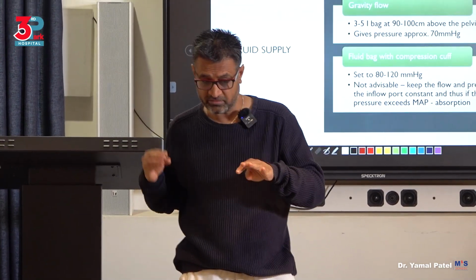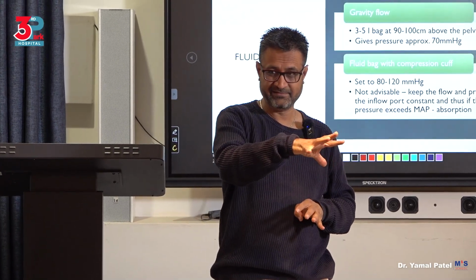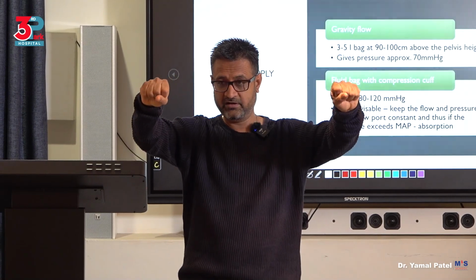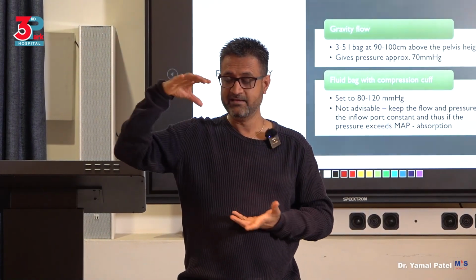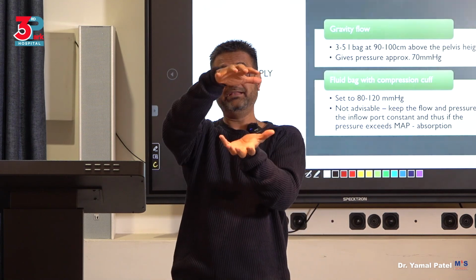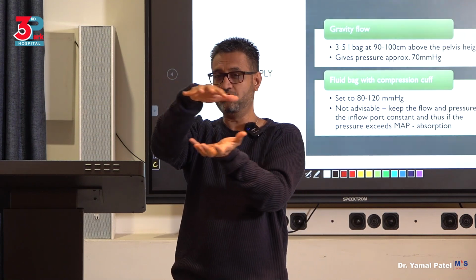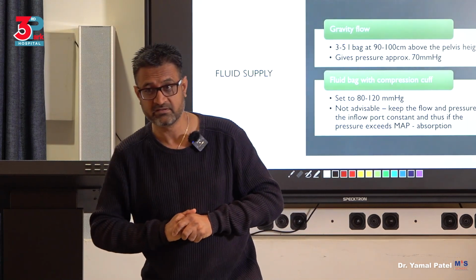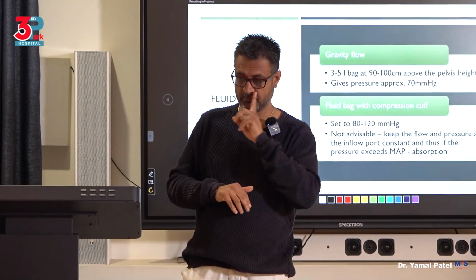If it goes low, more fluid is pumped in. If it goes higher for some reason, because there's a block everywhere and fluid is now just distending, the fluid should stop going in and just allow it that way, because it's already giving you a good view. You've now understood. Constant pressure, variable flow.